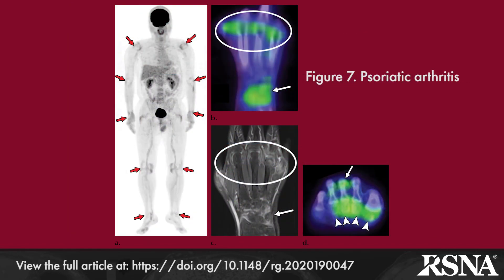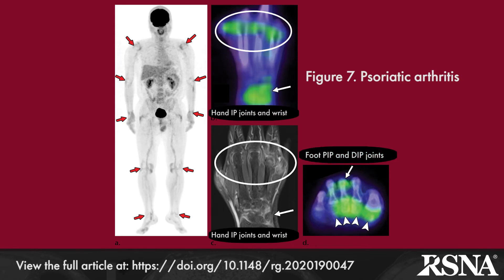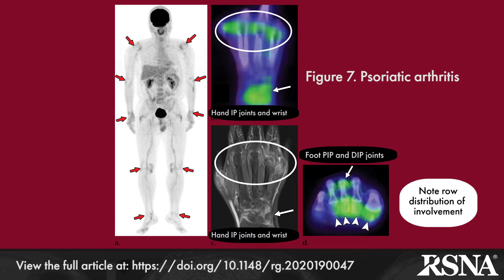Psoriatic arthritis is another spondyloarthritis seen coincident with or following a diagnosis of psoriasis. Asymmetric oligoarticular arthritis of the distal hands and feet in a ray pattern, or involving a single digit, is most common, followed by SI joint and spine involvement.